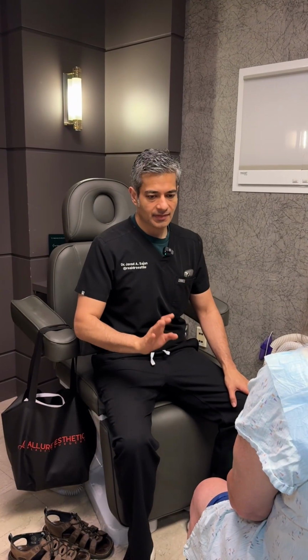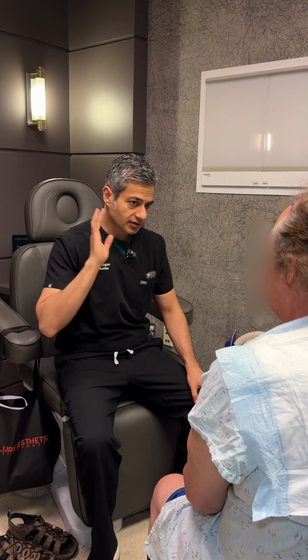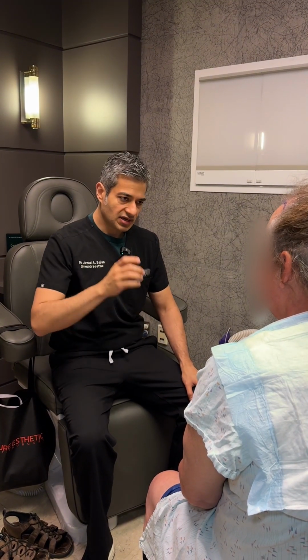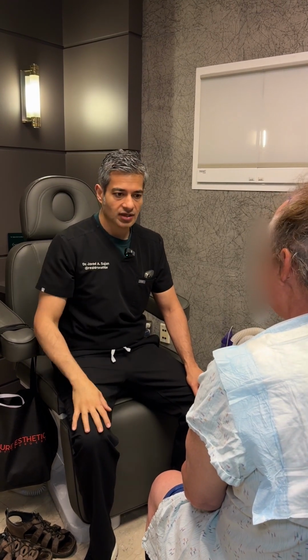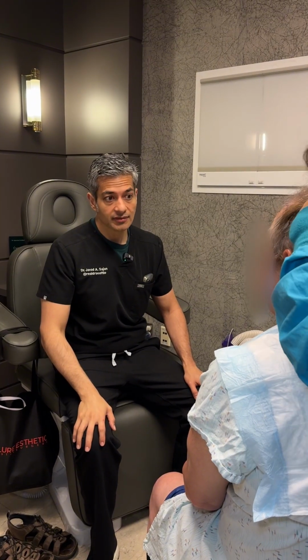So our plan is in the OR, IV, get you a little relaxed, nerve block, take the strip out, you're going to hear and feel some noises, stitch that up nicely, make a grid pattern for the transplant. We'll make holes in the grid, then we'll put the hairs in, okay? So it'll be 4 of us working together, trying to get this done beautifully and nicely, okay?